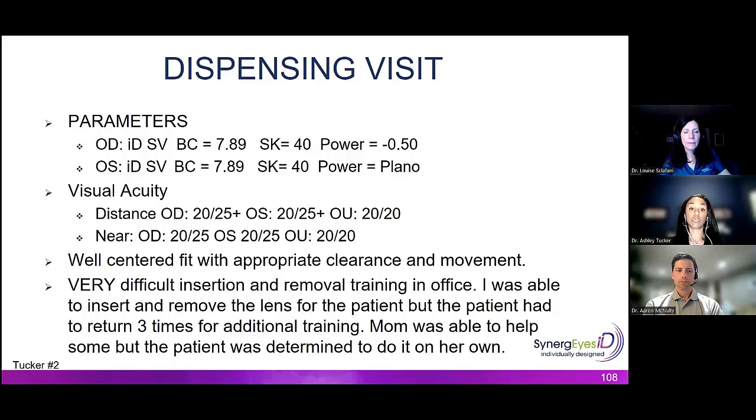Her acuity was really good, 20/25 plus, with each eye individually, and both eyes open 20/20. I'm with Aaron with not nickel and diming over refractions. I knew I maybe could do a little bit better on the acuity, but she was so excited to be able to see and be in contact lenses for the first time that I didn't really over refract at this visit. The lens was well centered with appropriate clearance and movement.